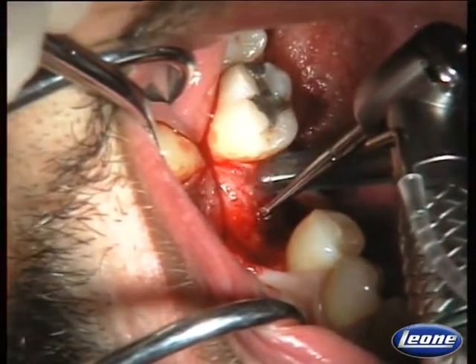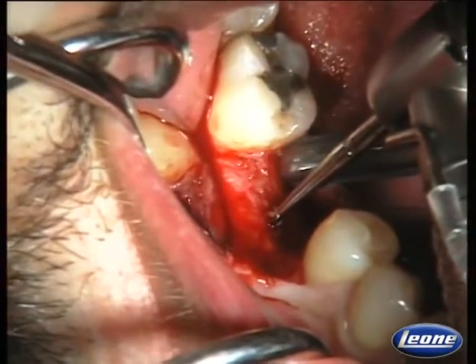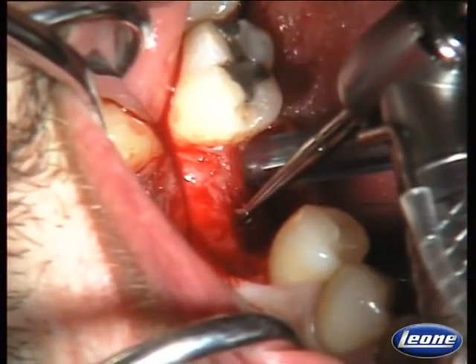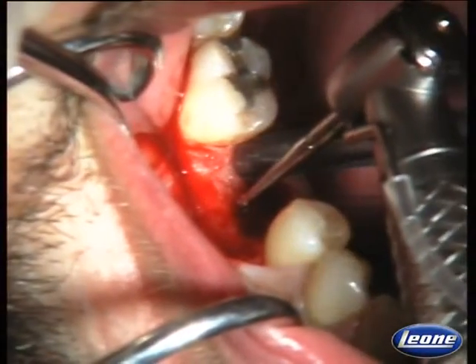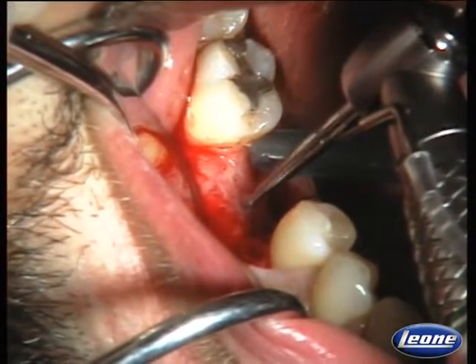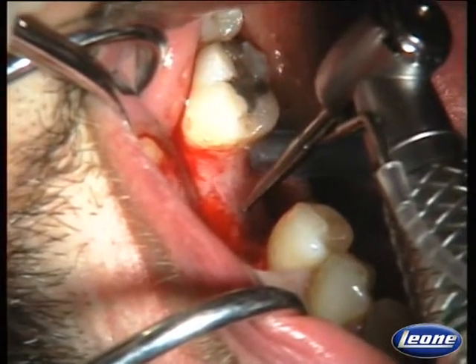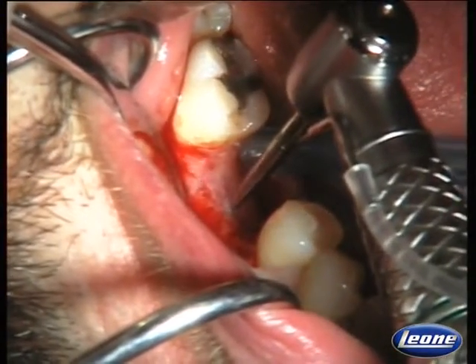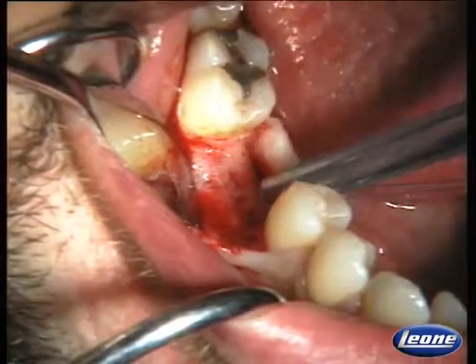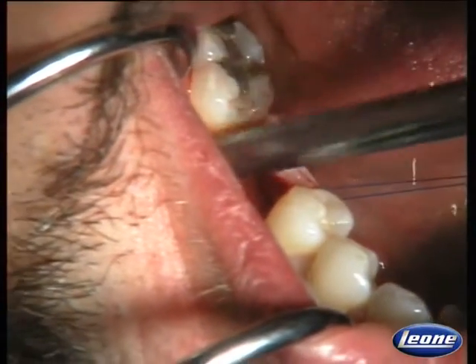Now we have an optimal visibility, and first of all we are going to mark the insertion point of the implant. In the middle of the interdental space, at the center of the bone ridge, I mark the insertion point. Once that's done, the pilot drill is used to start the osteotomy.